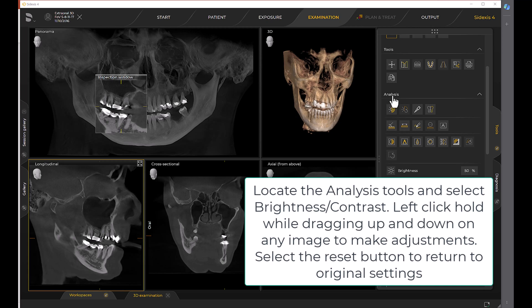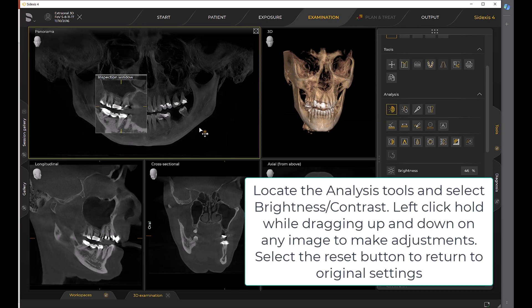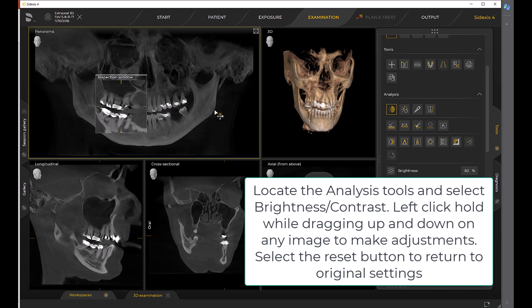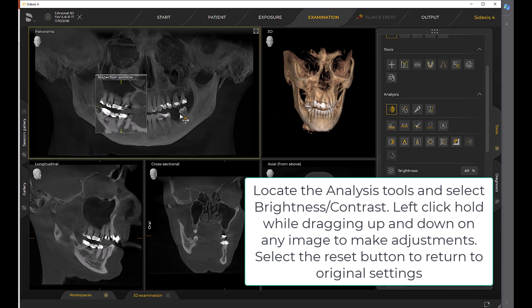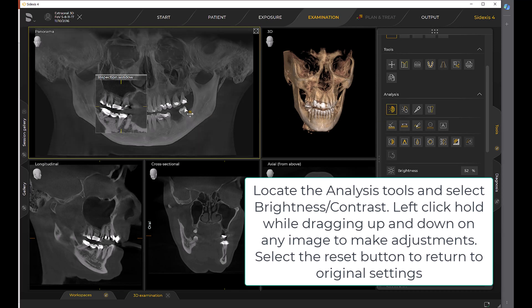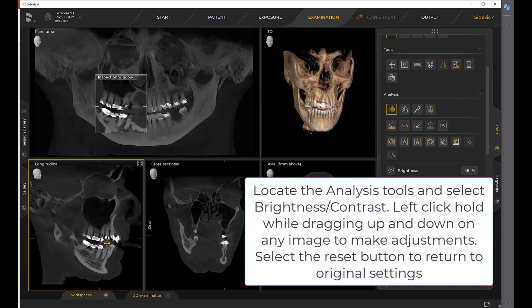Locate the analysis tools and select Brightness Contrast. Left-click hold while dragging up and down on any image to make adjustments. Select the Reset button to return to original settings.